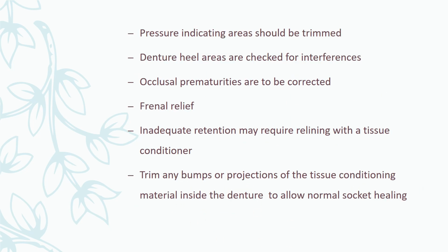Pressure indicating areas should be trimmed. Obviously, these things have to be trimmed. Denture heel areas are checked for interference. Wherever there is healing, any interferences, any extra tissue, anything has to be taken care of, and the counterpart in the denture has to be checked and trimmed off.